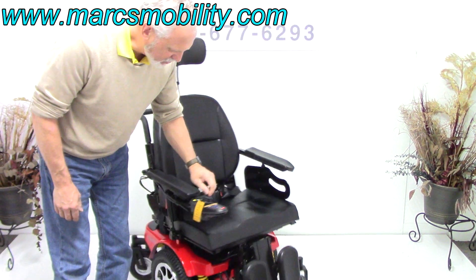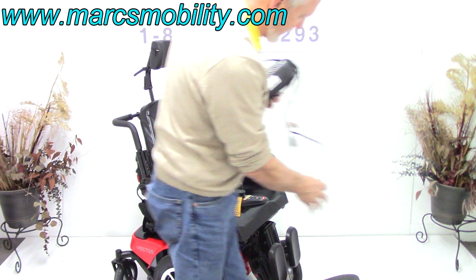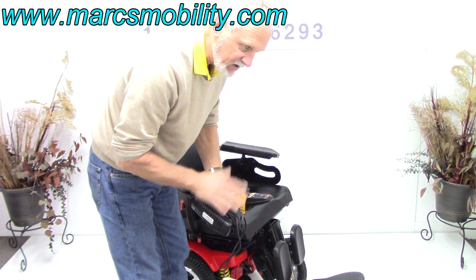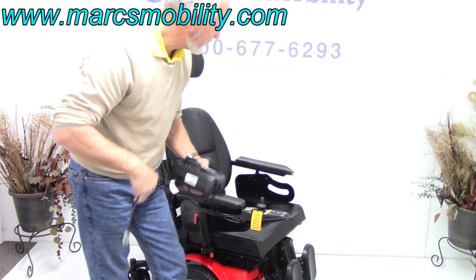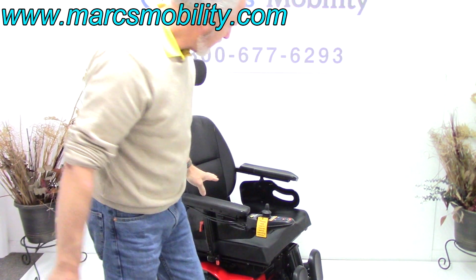When you charge this chair, like most new power chairs today, you plug your charger right below the joystick and into the wall. As soon as the light turns green, you're fully charged. Your charger will stop charging automatically when the batteries are full, so you don't have to worry about overcharging. This chair has about a five-mile-an-hour speed limit.